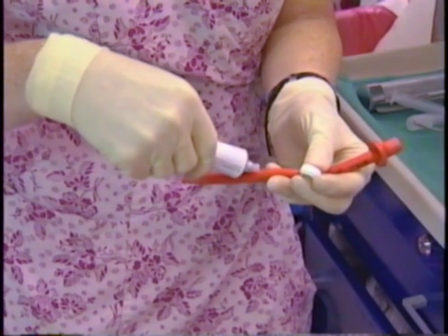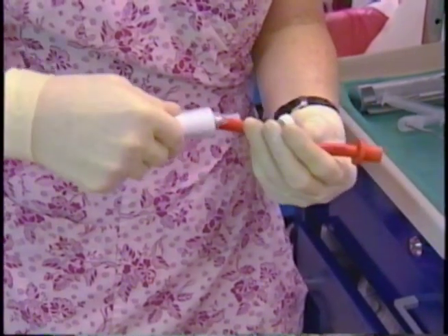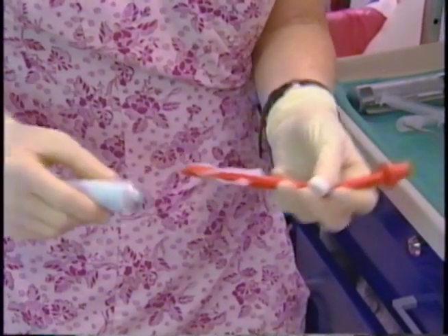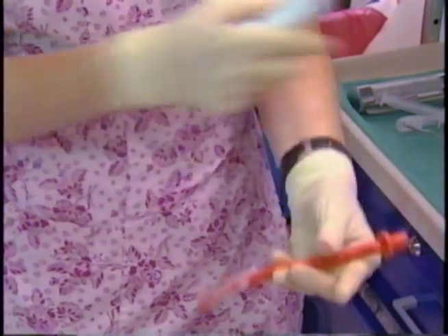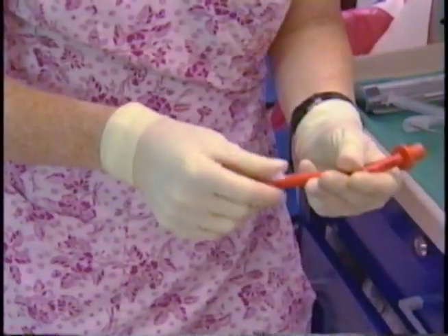Always lubricate it well with a water-soluble gel. A local anesthetic gel is best because it also numbs the nasal passages. Avoid plugging the tube with gel.